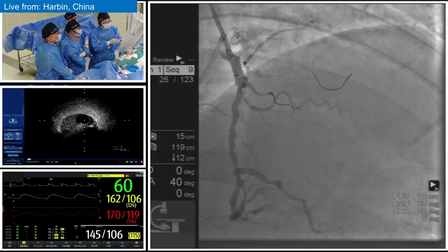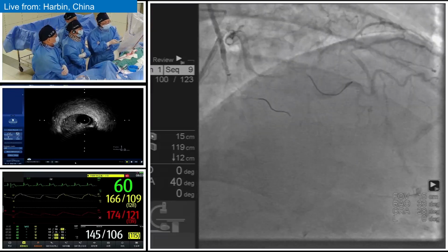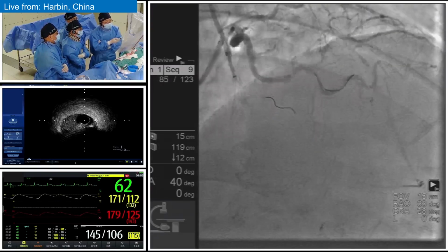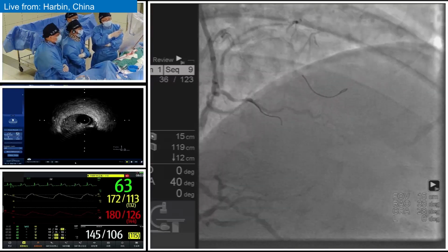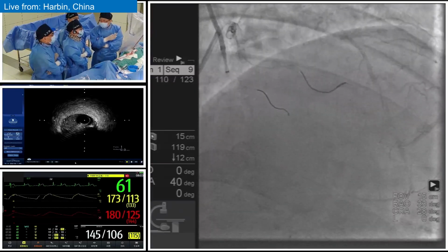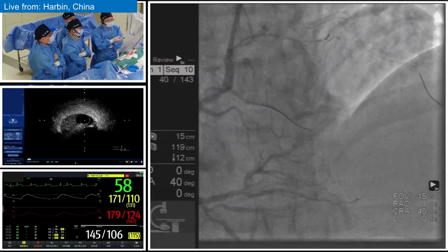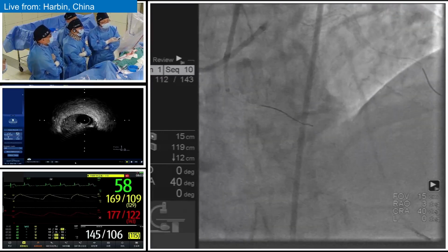And this is the bilateral angiogram, RAO cranial. We can see the occluded segment and really the LAD with calcification. We can see in the middle portion of the LAD, just at the diagonal branch area is patent, but before the diagonal branch there is some plaque. And okay, let's see the AP view.